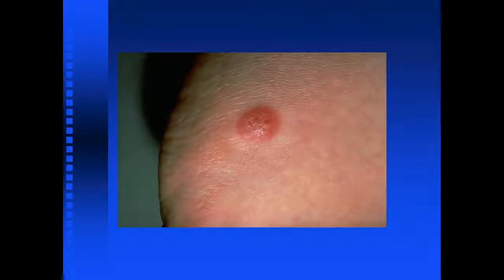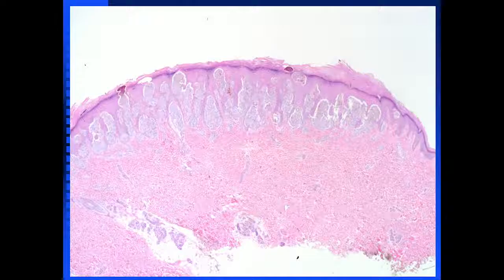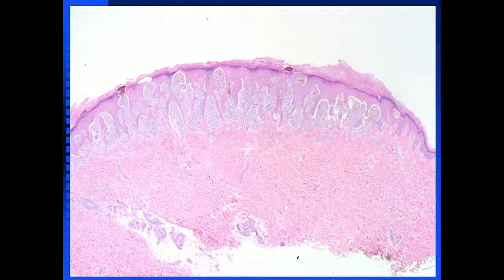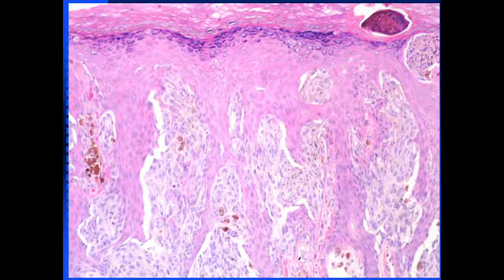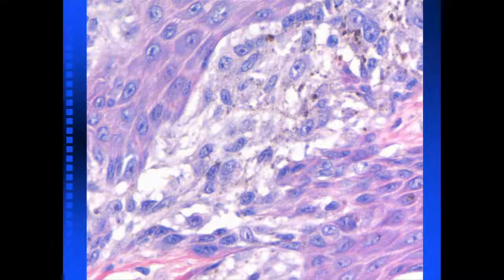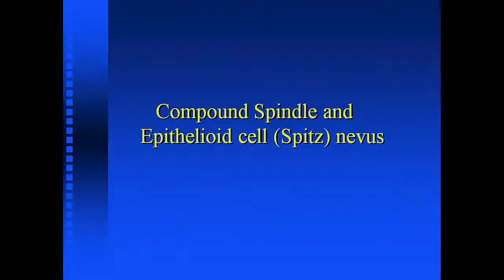So we know what a typical Spitz nevus is. I hate terms like typical and atypical Spitz nevus because Spitz nevi are typically atypical — so is an atypical Spitz nevus atypically atypical? Here you can see an atypical Spitz nevus: a primarily nested melanocytic proliferation with banana-like sheets of melanocytes, clefts, transepidermal elimination, sharp lateral demarcation, uniform cytology, acanthosis of the epidermis, and large atypical cells. It is still a Spitz nevus, also called a nevus of large spindle and/or epithelioid cells, named after Sophie Spitz.